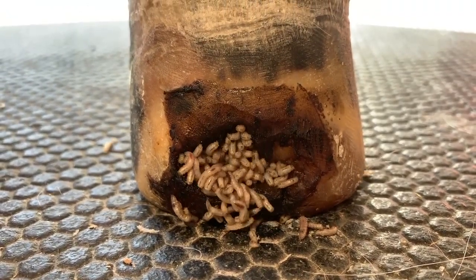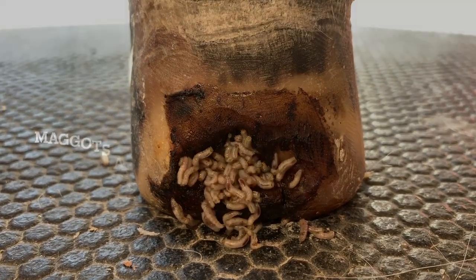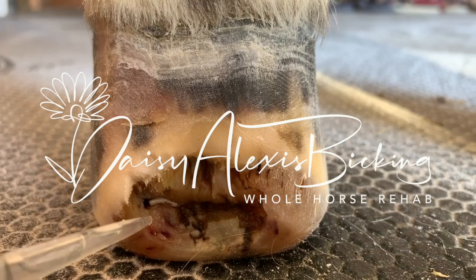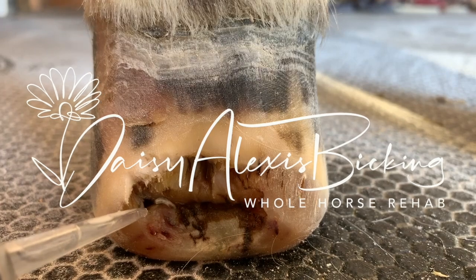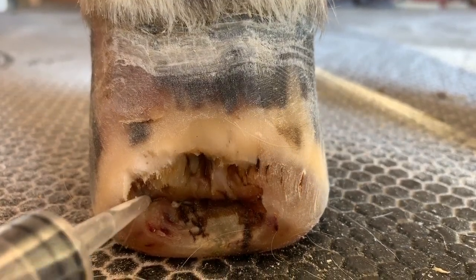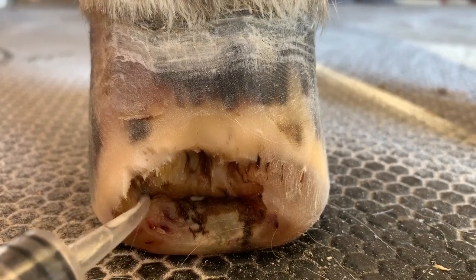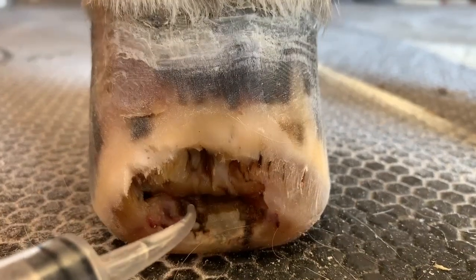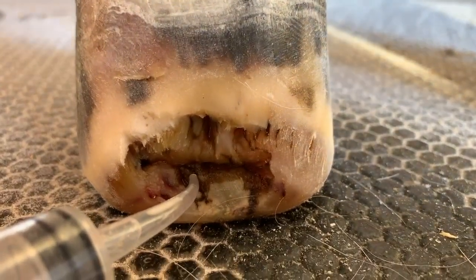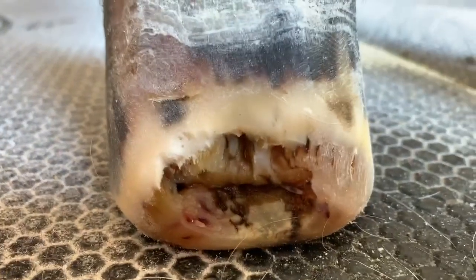Hi guys, happy guys! See him coming out of there — came out of that hole right there. Oh my gosh, like how far in does that go? That pocket right there — and then look, he just went under there, he just escaped under there. Oh there he is, sorry buddy, time to come out.